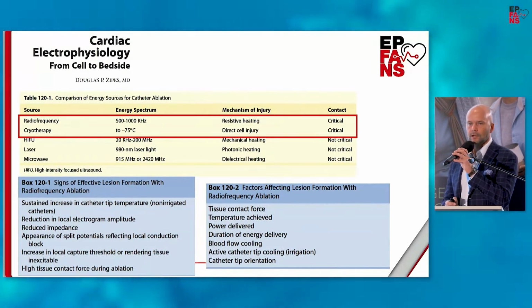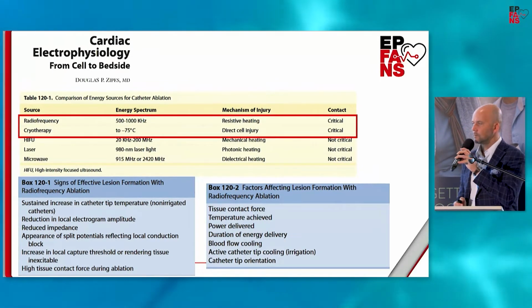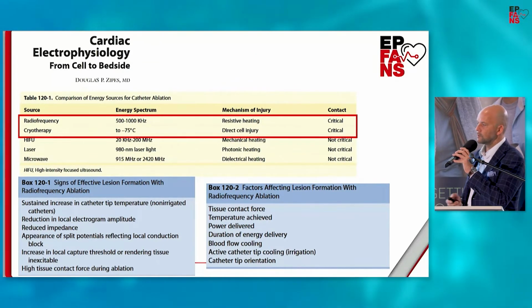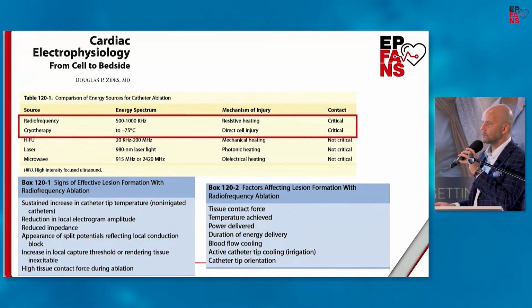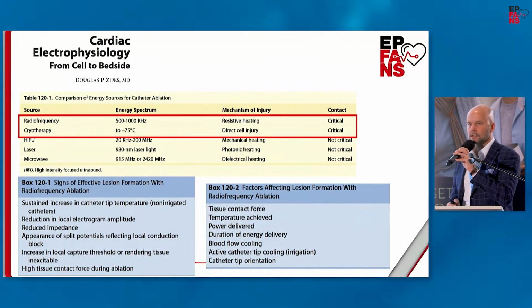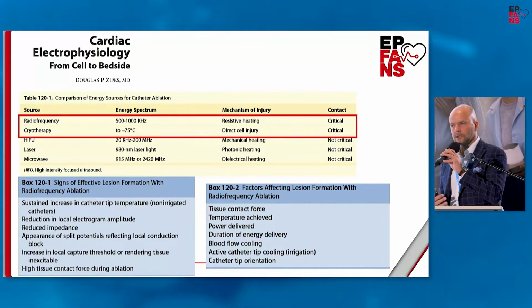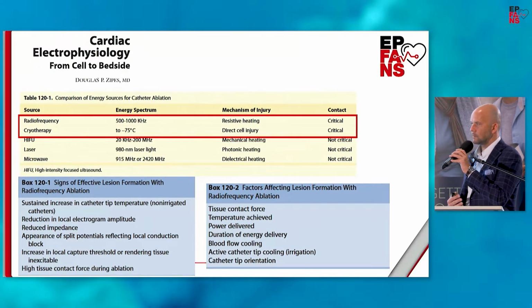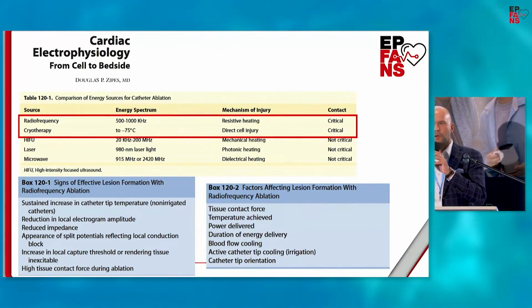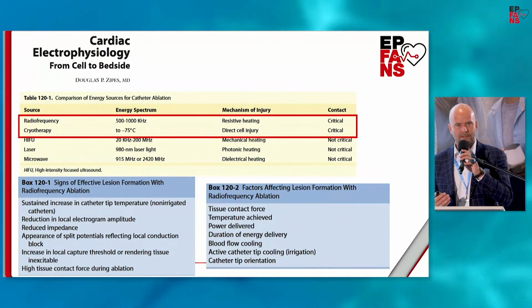It is also important to know the tip-to-tissue orientation and the catheter construction with temperature sensor location, because it is crucial for interpretation of displayed ablation parameters. In other words, remember, you must know how the tools you are using work and how they are constructed.